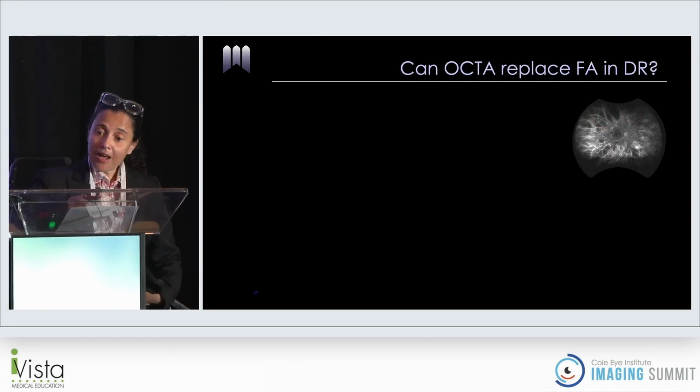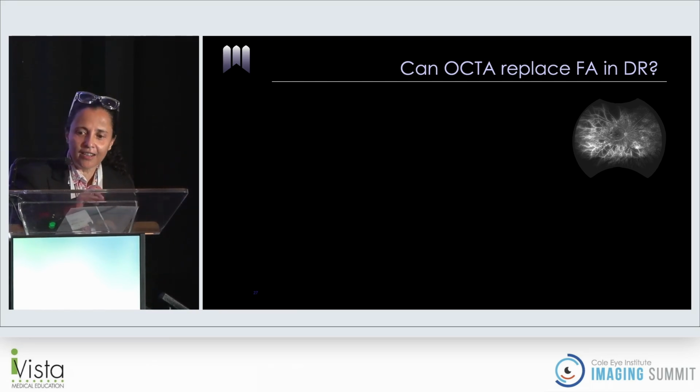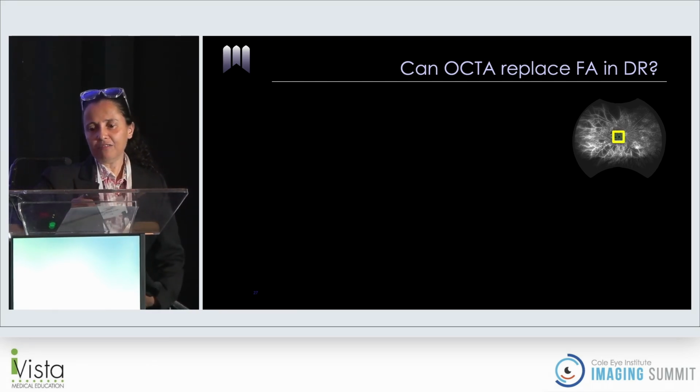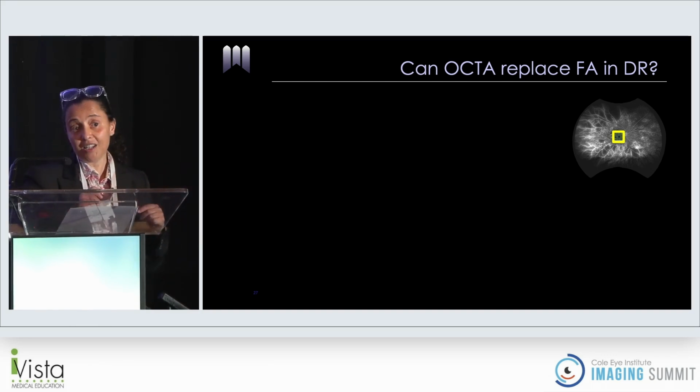So in diabetic retinopathy, it's a different story. You know, we do a lot of research in diabetic retinopathy. We order a lot of OCTA in diabetic retinopathy, but really we haven't gotten to the stage where we could forget about fluorescein angiography in diabetes yet.